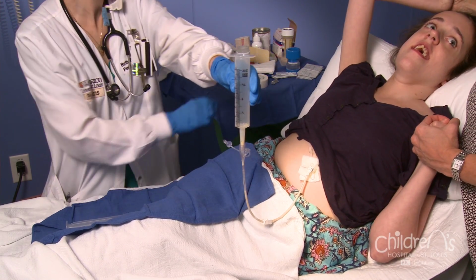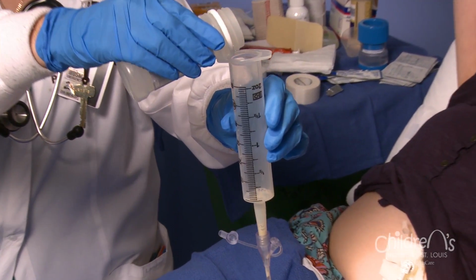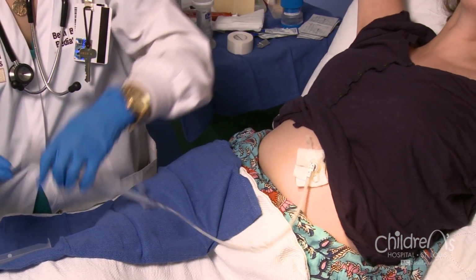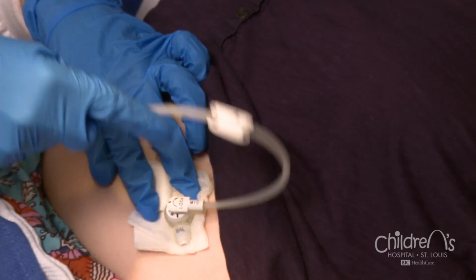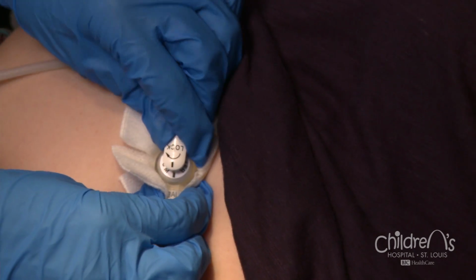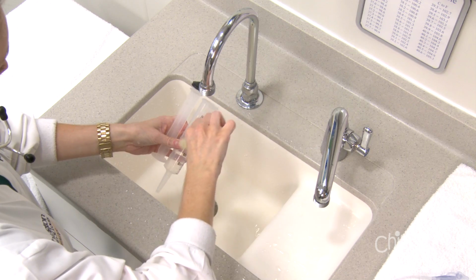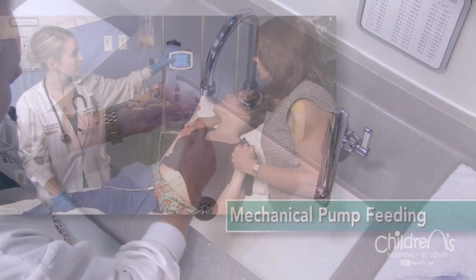When the feeding is complete, flush the extension set with 5 to 10 milliliters of water. Clamp the extension set and then disconnect the extension set by turning at least 1/4 turn counterclockwise. The black marks will line up again with each other. Then remove the extension set by holding the button and gently pulling on the extension set. Then wash supplies with soap and water, rinse, and allow to air dry.